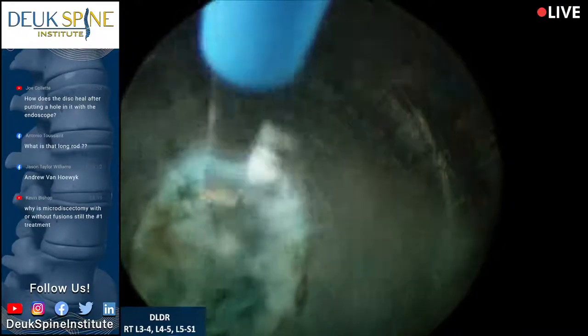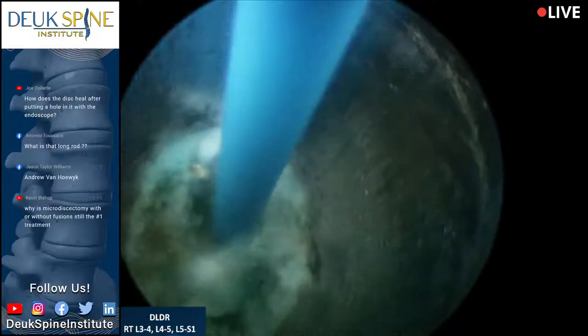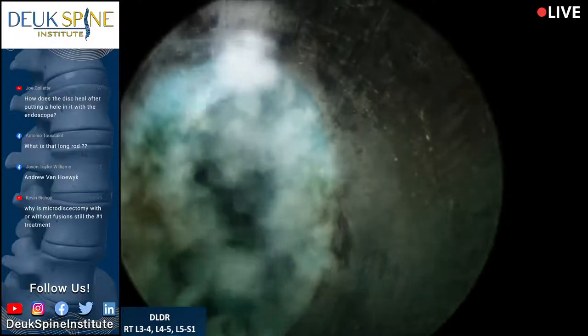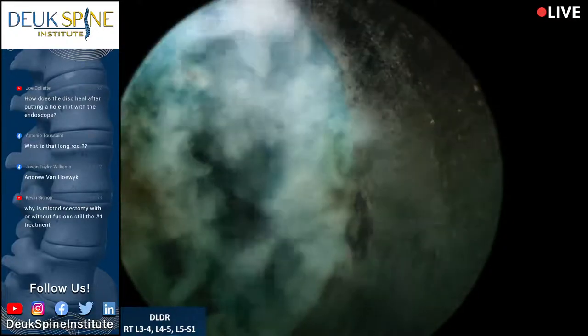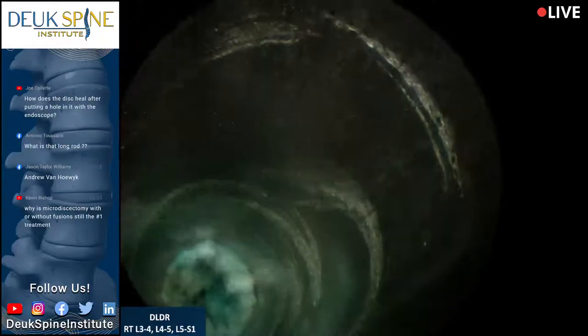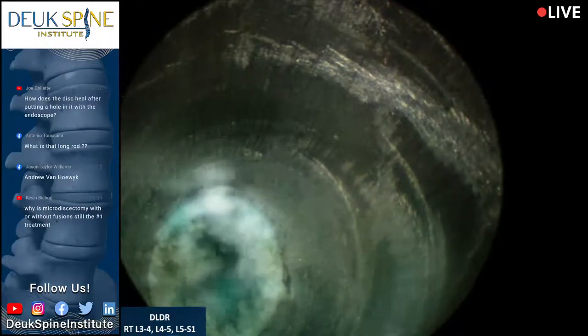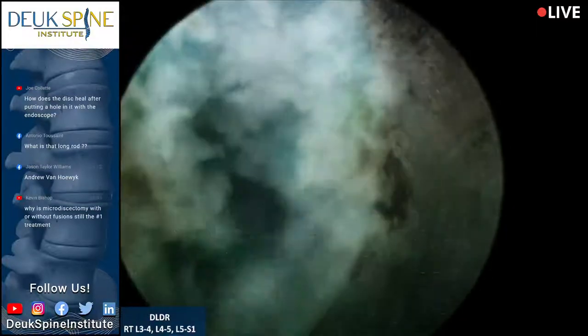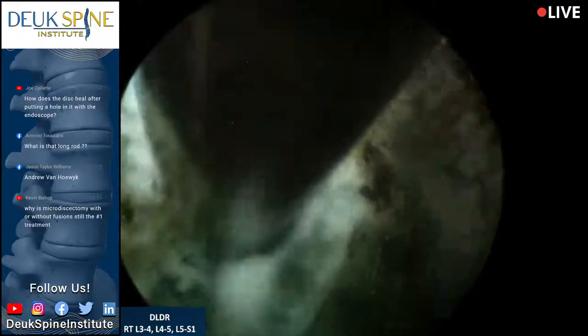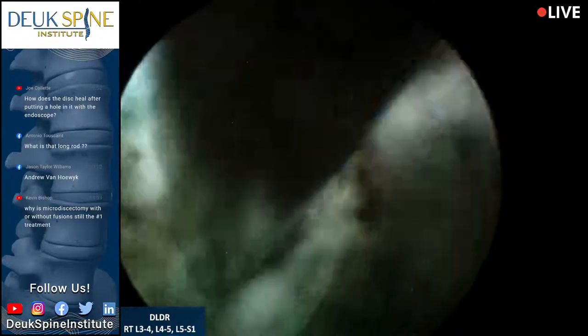This disc is pretty badly damaged, this L3-4. To me, you can see all the fragmentation of the nuclear material, the blue stuff. Lots of pieces. That's an indication of pretty significant trauma to the disc over the years. And that trauma can come in the form of falling or car accident or a sports-related injury. The good news is when we're done, this pain will be gone from this disc.